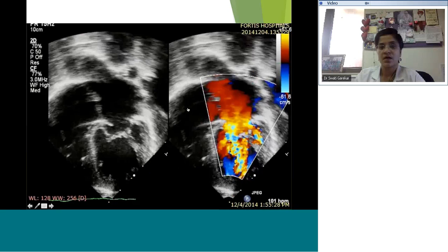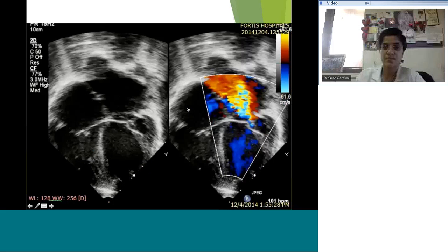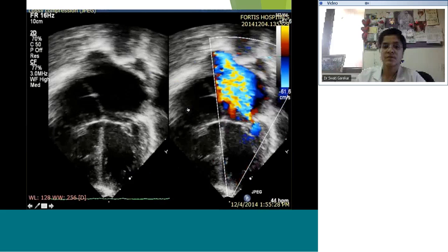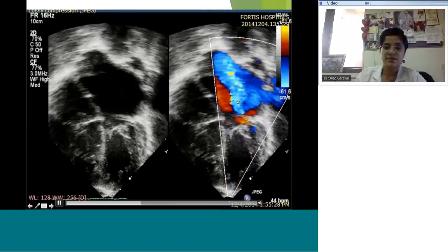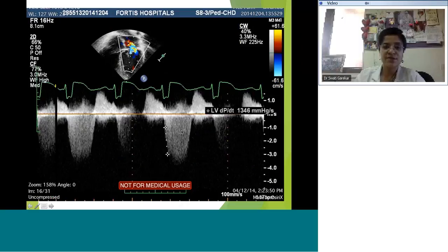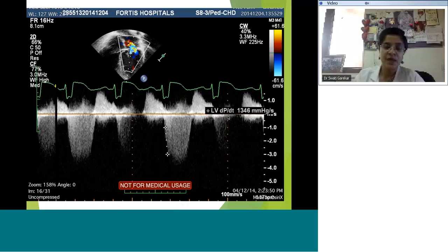On color flow you see multiple jets of regurgitation — one particularly laterally situated, not central, which is pretty large. We're also measuring LV function using LV dP/dt — that is, pressure change over time. Using the mitral regurgitation signal, normal LV dP/dt should be around 1200 to 1300 mmHg per second.